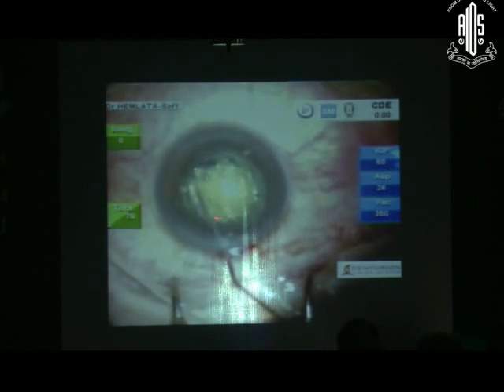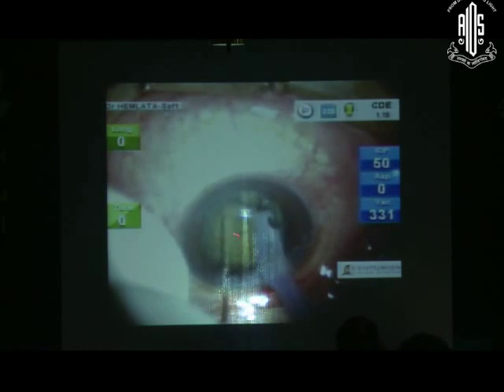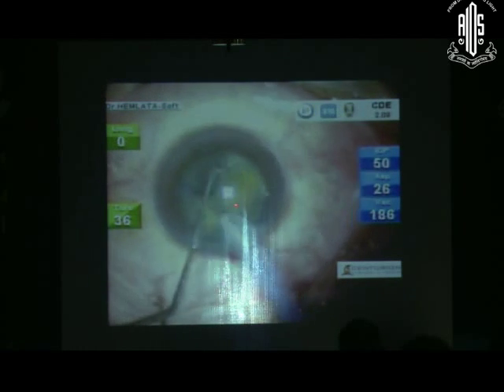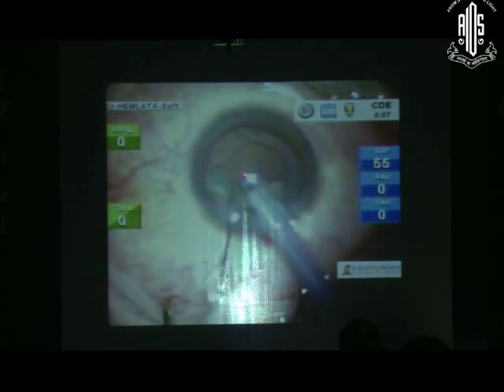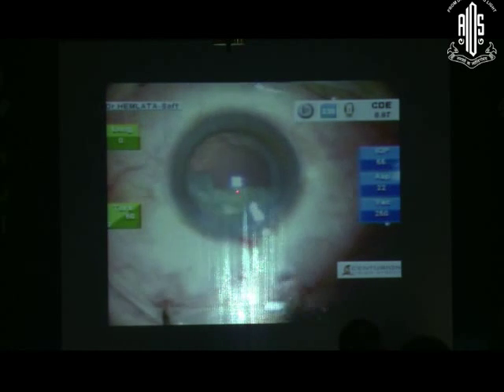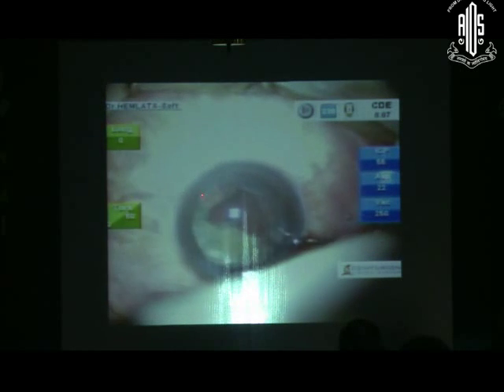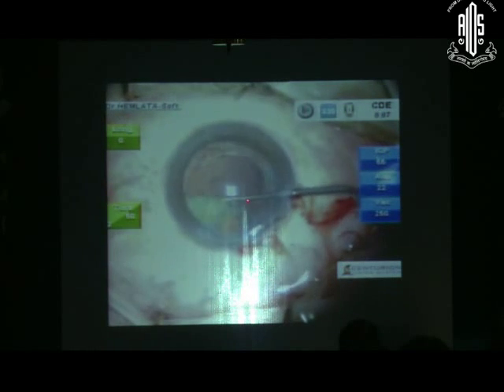We go ahead. We have a wonderful capsulotomy. In a posterior polar, you would wish to have a wonderful capsulotomy, and you see that the posterior part is still there. So I have removed one quadrant. This is the second quadrant that is being removed, and you can see, lo and behold, I immediately get a rent. So don't withdraw. Inject viscoelastic, must have been told to you. And after injecting viscoelastic, you have some cushion for the nucleus.